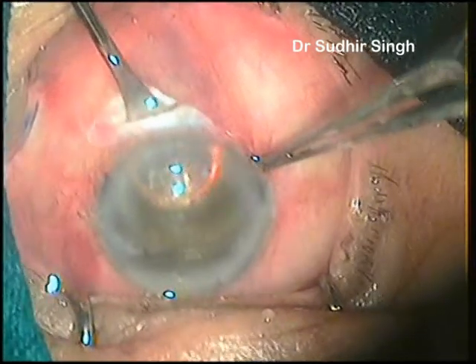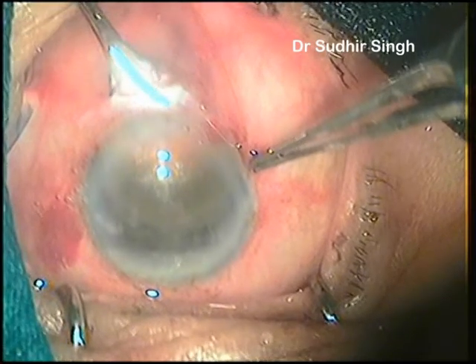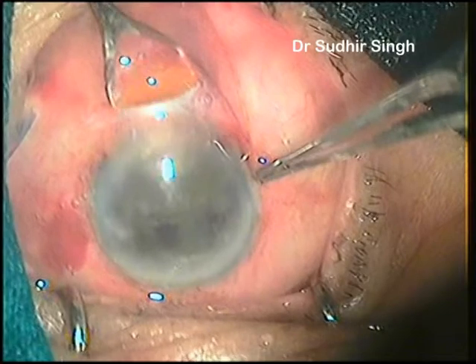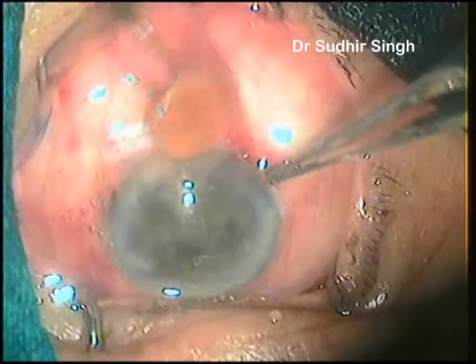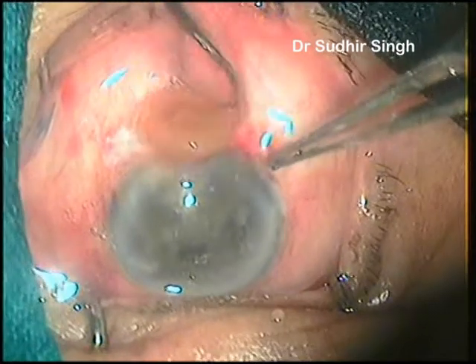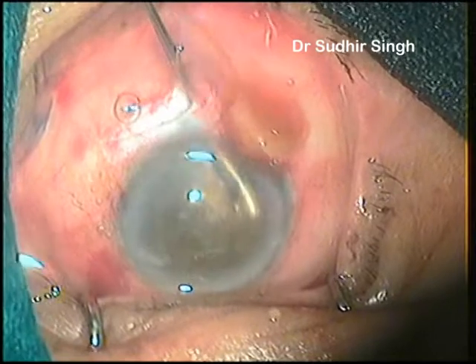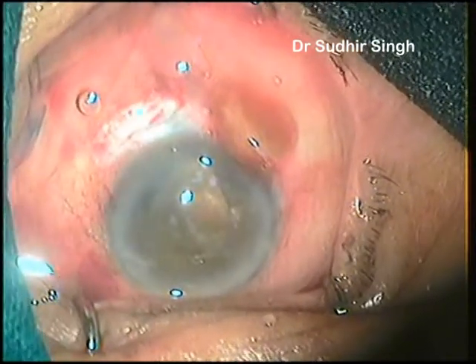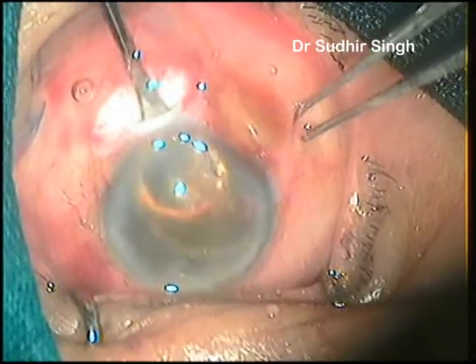This causes the entrapment of the nucleus in the tunnel. Now the vectis handle is lifted about 45 degrees away from the limbus and then pulled out. This causes the breaking of the nucleus inside the tunnel. The broken posterior part of the nucleus is taken out and the remaining anterior part is pushed back into the anterior chamber. The longitudinal axis of the remaining nucleus is made parallel to the tunnel and taken out by the vectis.